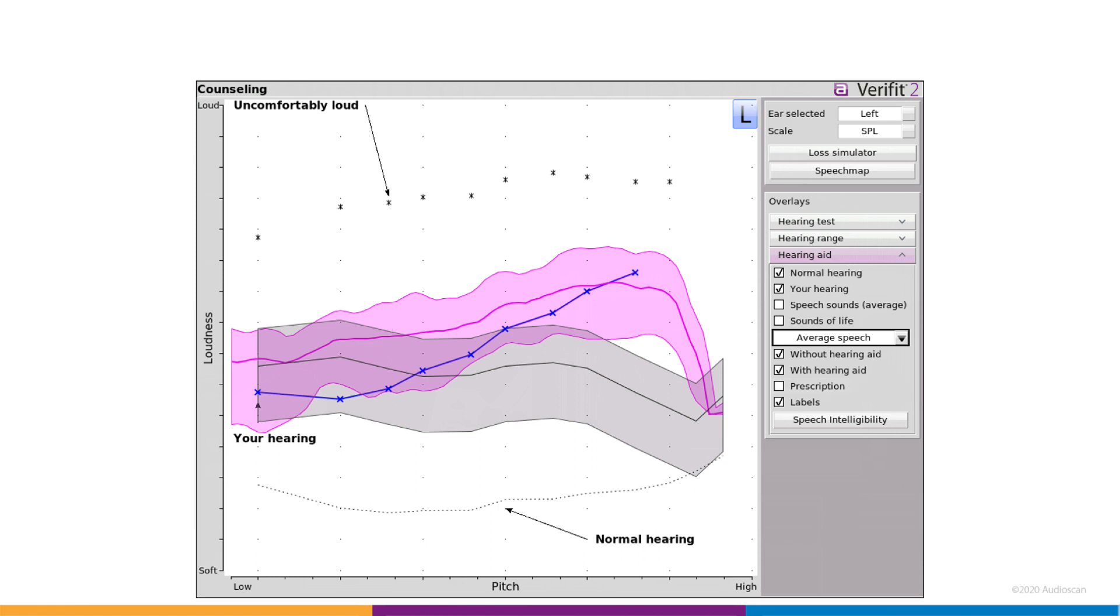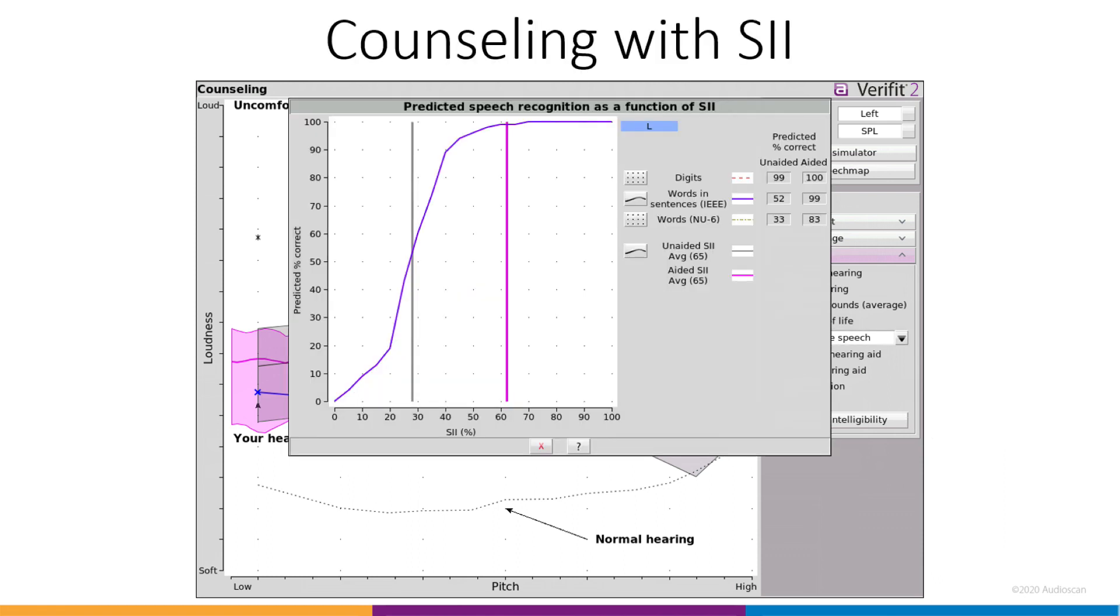For any of the selected speech test levels, the speech intelligibility button will bring up our SII counseling tool to aid in the discussion around SII prediction of performance on speech recognition tests. This tool is still available in the regular speech map screen as well.